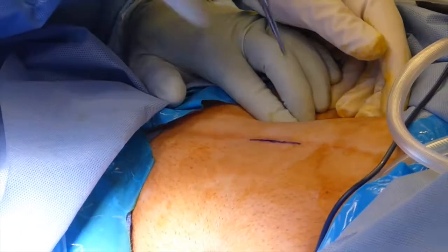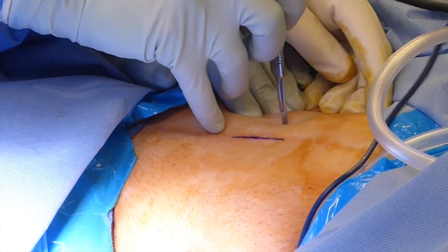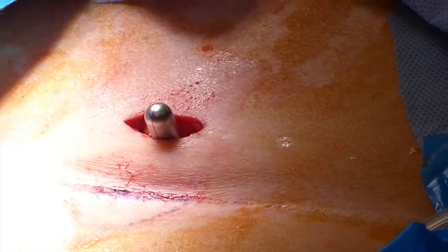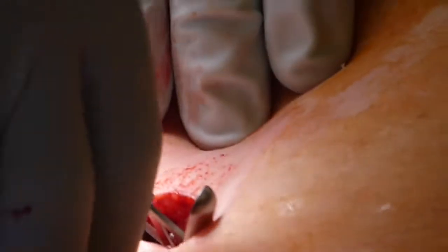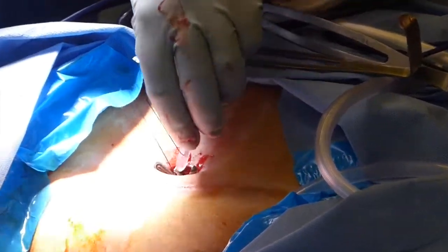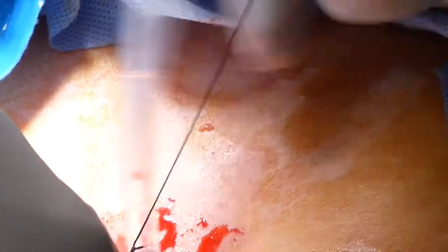Make an incision over the tip of the Lousley to accommodate the Foley to be used. Extend the incision down into the fascia and bladder while maintaining upward pressure with the Lousley tip. The tip will pop through the incision when the final layer has been breached. Open the jaws and thread a free tie through the wings. Use the tie to secure the Foley tip to the Lousley to prevent losing the Foley in transit — should that occur, a cystotomy is often needed. This step prevents such a mishap.